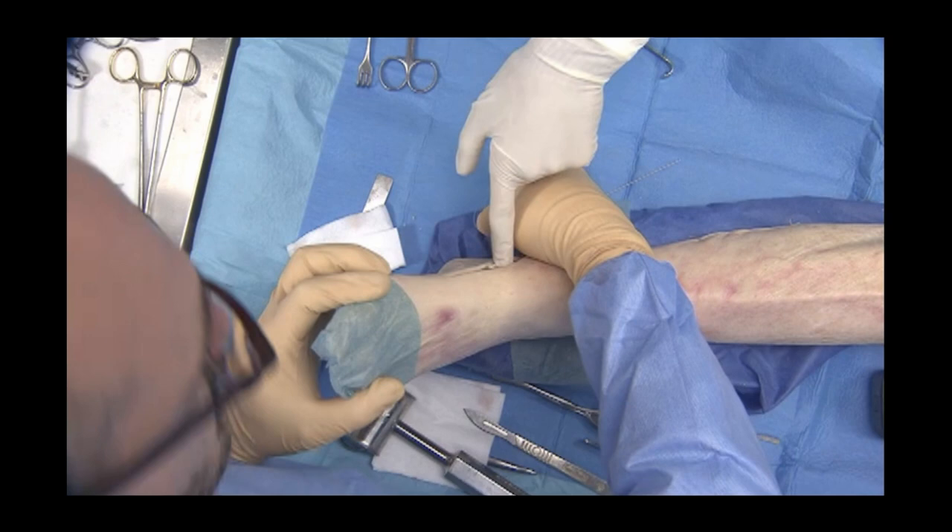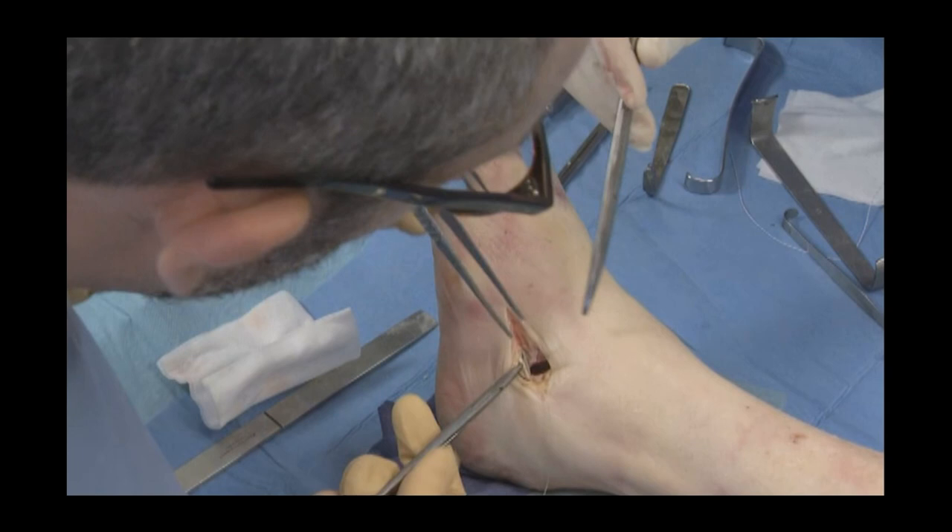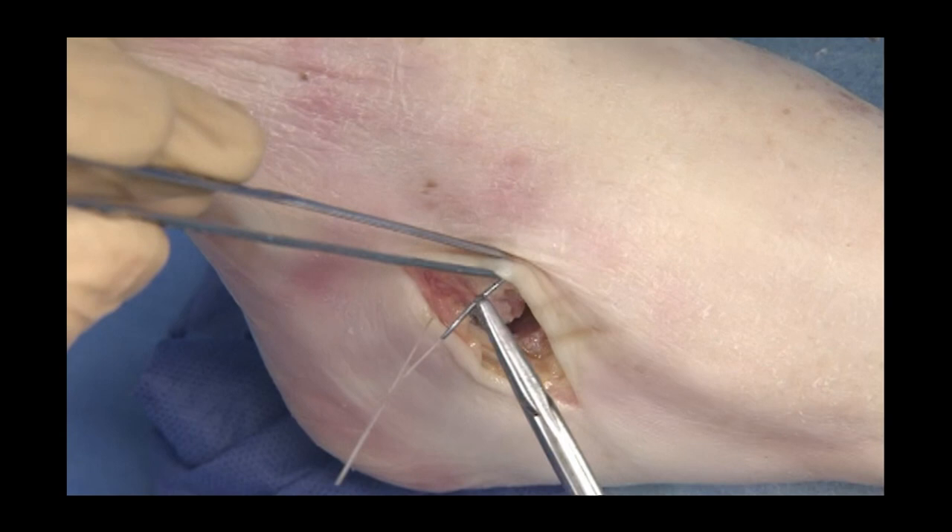Deformity correction efficiency is controlled on the medial side, and soft tissue procedures are completed at this time. Wound closure is performed by stitching the extensor retinaculum to the peroneal sheath.